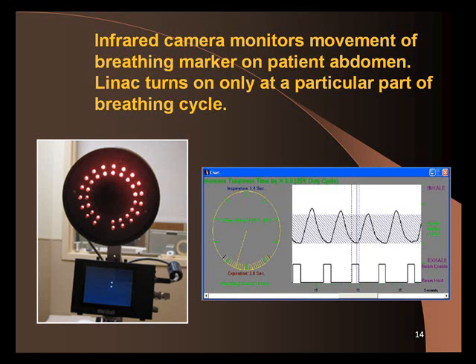And so now, if we know the breathing of the patient, now this is for radiotherapy, we can say, well, we don't want to treat the entire time because the tumor moves around too much. And if we're going to narrow down our margins, so here's a slice of the patient. Here's 2 lungs, and there's a tumor here. And that tumor moves in all directions, but just for simplicity, say it moves up and down in this case.